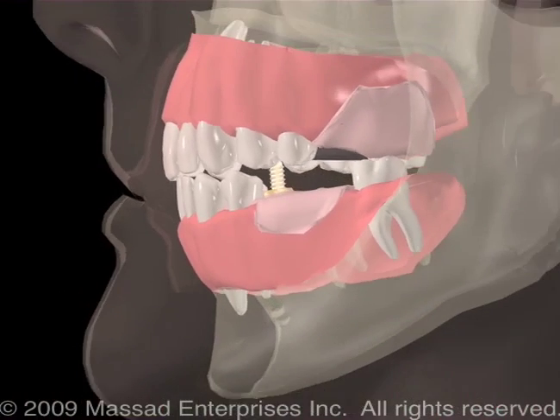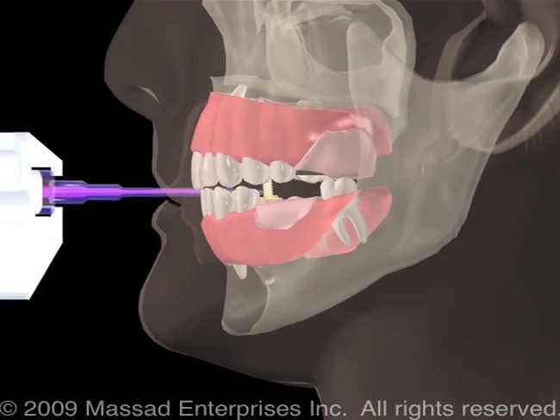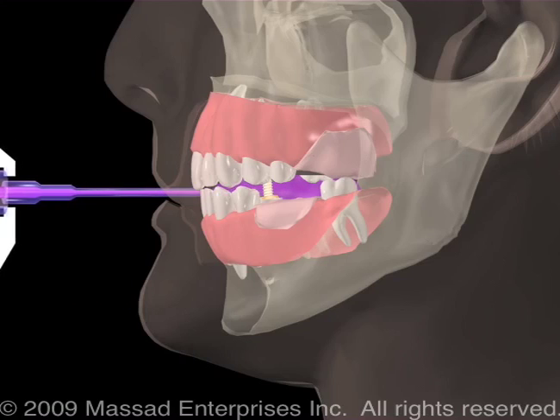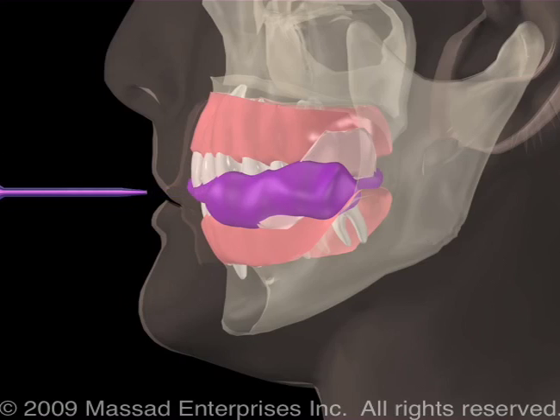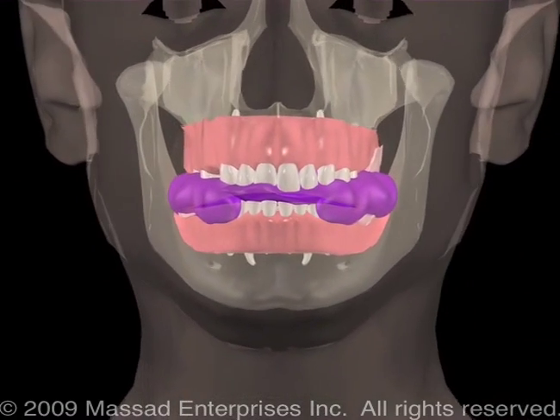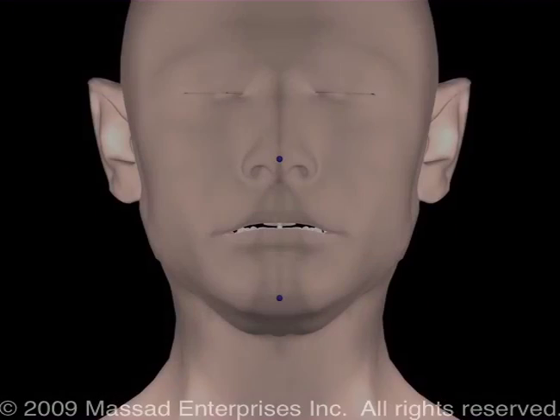Once the patient is closed at the apex of the arrow, it is now necessary to inject bite registration material between the spaces in order to transfer this record to the articulator. This demonstrates a slight opening, therefore, this must be mounted with a face bow and then closed on the articulator to allow for the appropriate freeway space. This is your final jaw record.